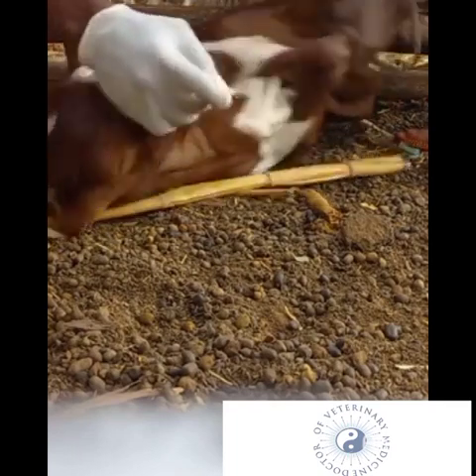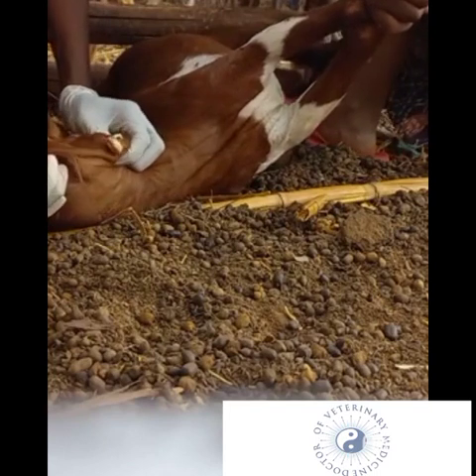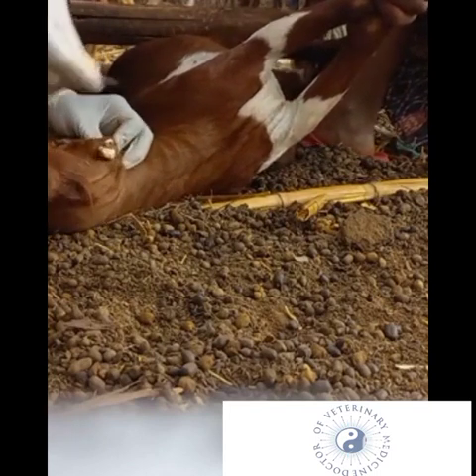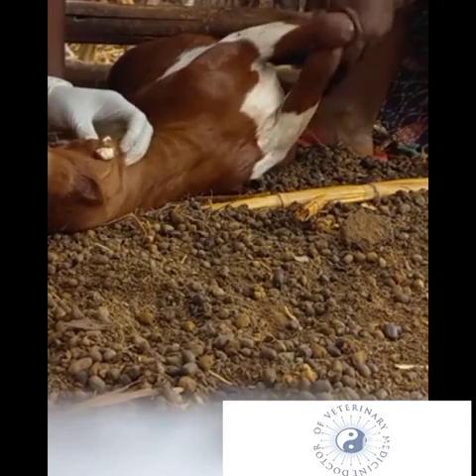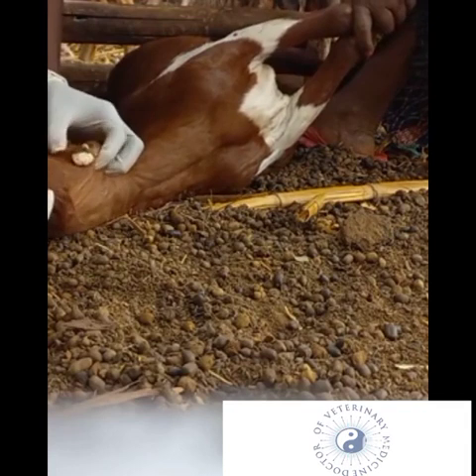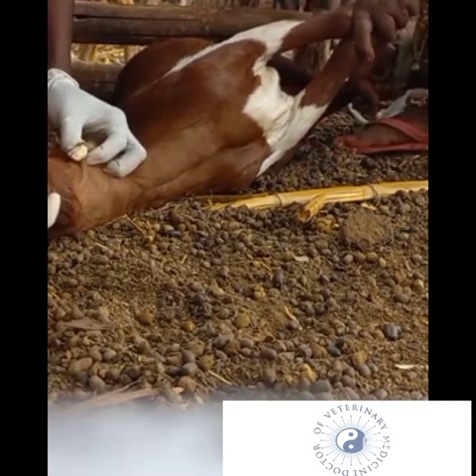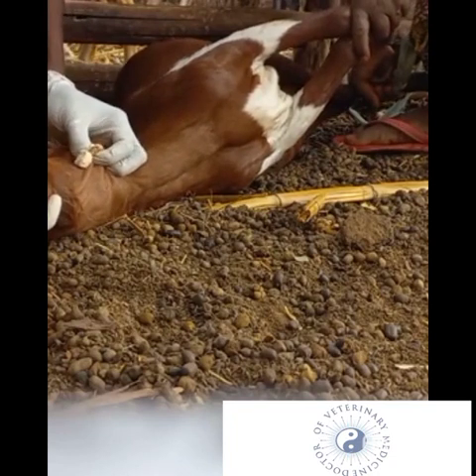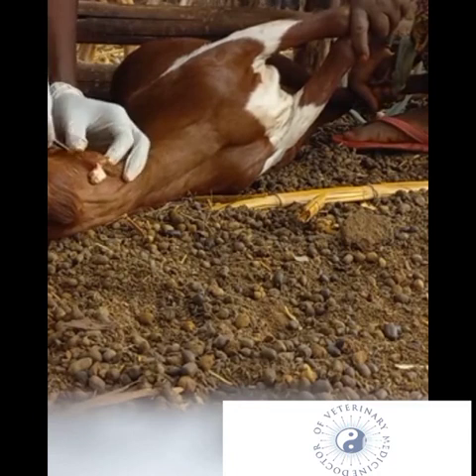So I'm trying to squeeze it, gently squeezing. Oh, very bad. Squeeze. And proceeding to make the incision at the suspect area. Wow. So let's get something here.